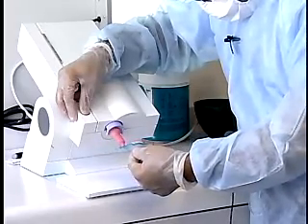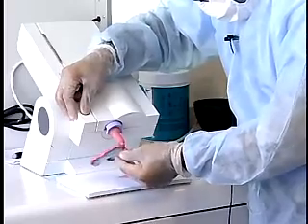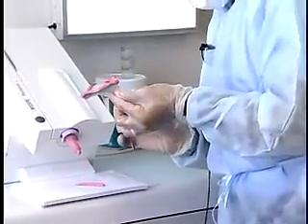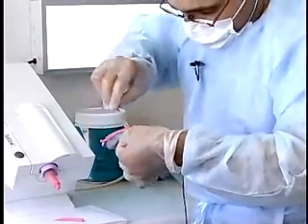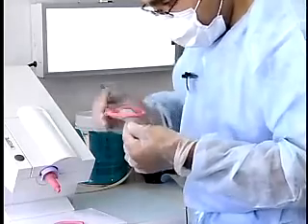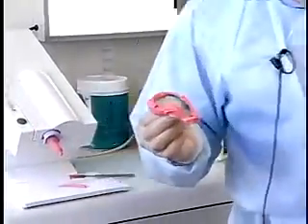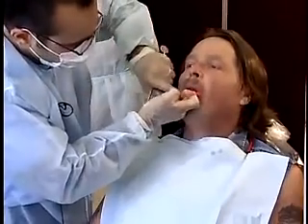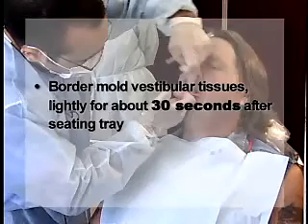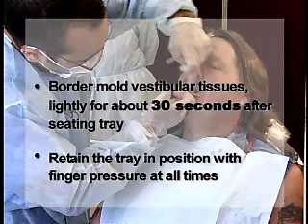Place heavy body elastomeric impression material along the periphery of the tray. Place the tray in the patient's mouth and instruct him to perform movements such as sucking a finger or pursing the lips. The vestibular tissues may be briefly and lightly border molded for about 30 seconds after the tray has been seated. Retain the tray in position with finger pressure at all times.